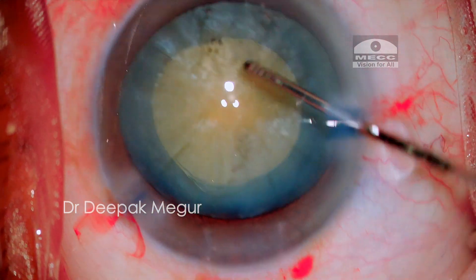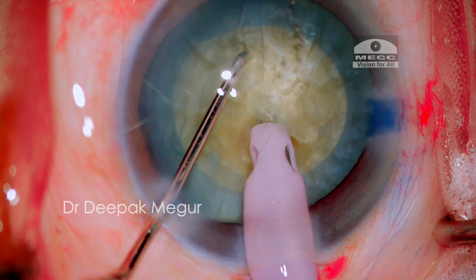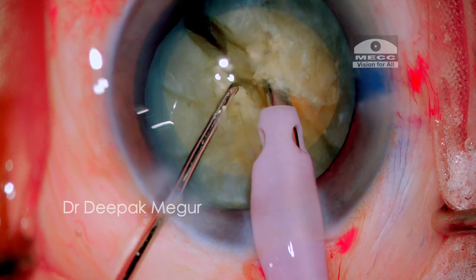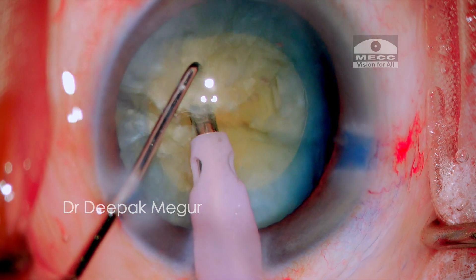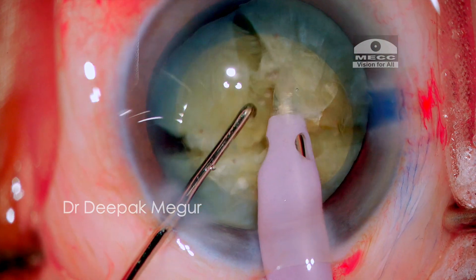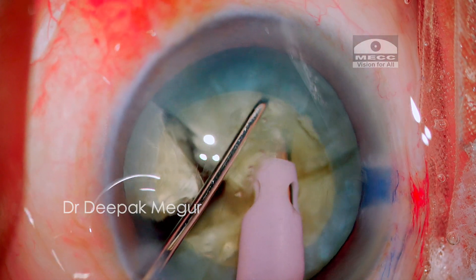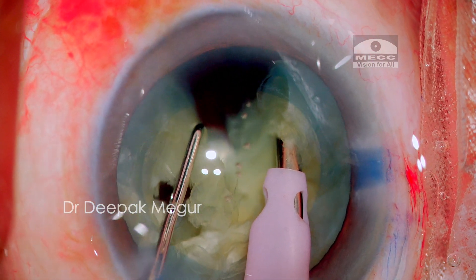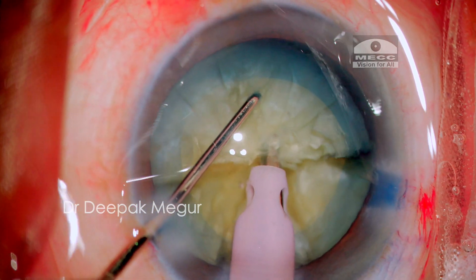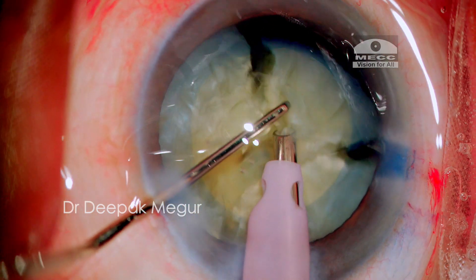Moving on to management of the nucleus, I am using a vertical chop technique. I bury the tip until the whole length of it gets into the substance of the nucleus, then the chopper goes down and then laterally. I realize the nucleus is much denser than expected — the first chop has not resulted in full separation; only the distal half is separated. I rotate it and the first hemisection is then vertically chopped, with lateral separation repeated at progressively deeper planes to achieve final fragment separation. This process of burying, chopping, and lateral separation at progressively deeper planes is carried out for each fragment until I have six fragments from this nucleus.